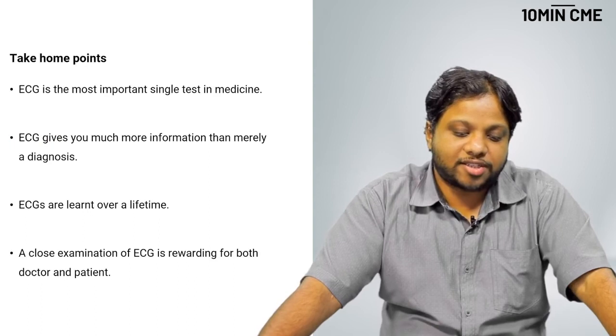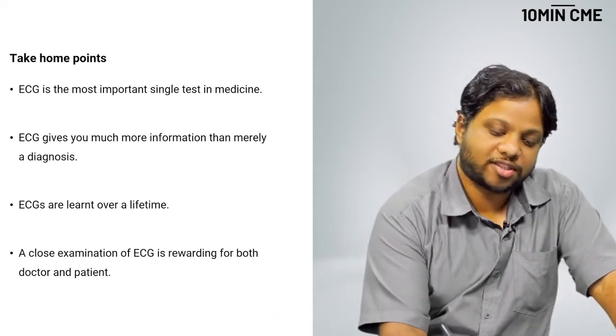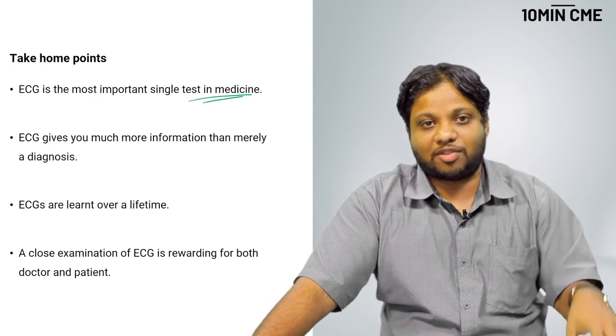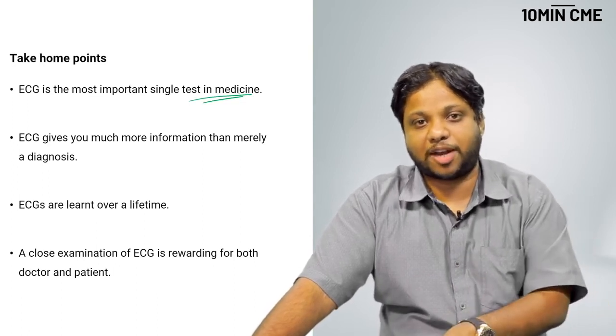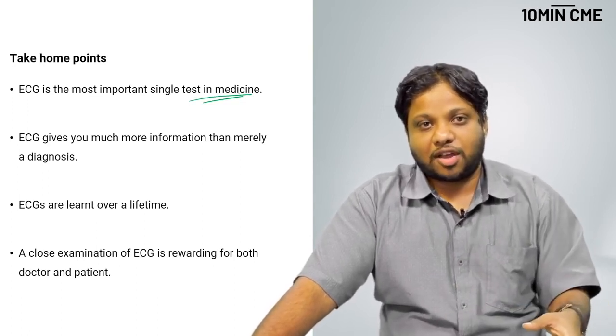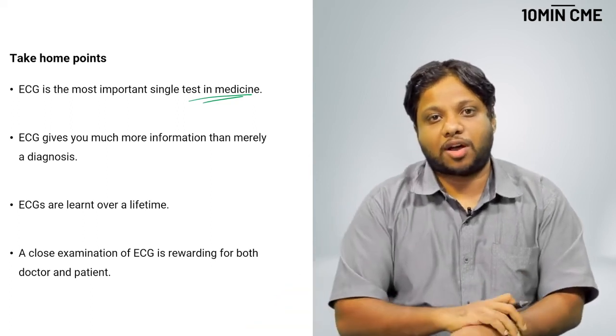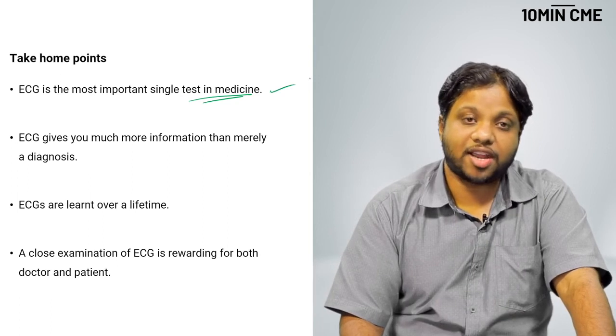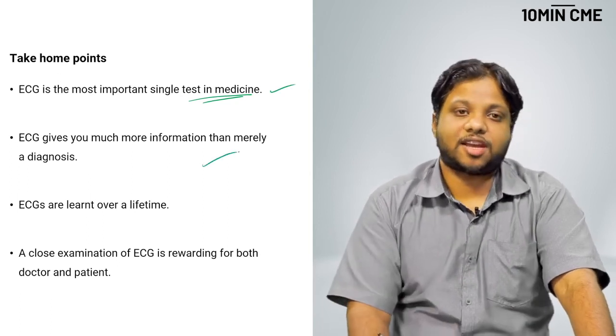So, take home points: the ECG, according to me, is the most important single test in medicine. I do not think any investigation gives you as much information about the diagnosis, prognosis, treatment, and pathophysiology for such a low cost as compared to your humble ECG. The ECG gives you more information than merely a diagnosis. ECGs are learnt over a lifetime.